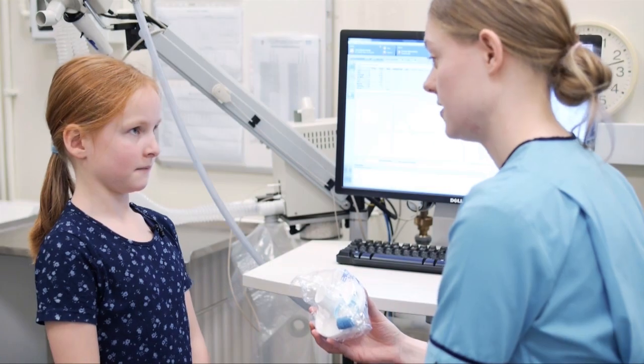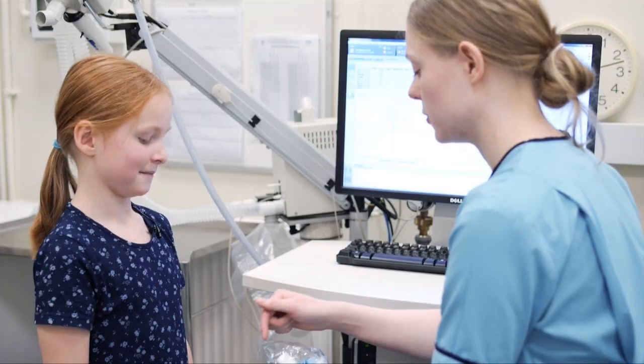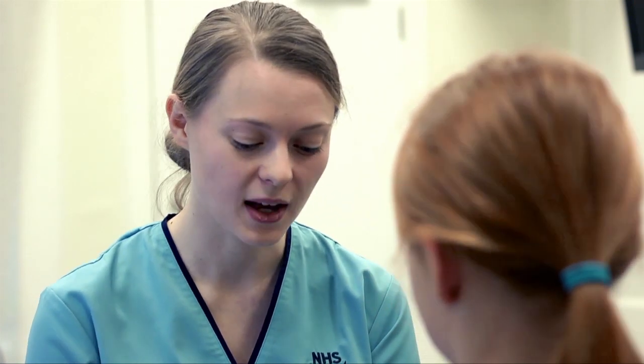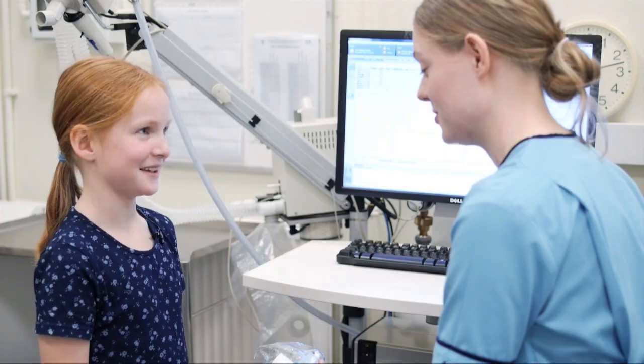Right Susan, we're ready to start now. Do you want to come across to my computer and we can have a wee look at the mouthpiece that we use for the tests? What we do is get people to put their lips and teeth around it nice and tight, but we don't want them to put their tongue too close to the opening just in case the air comes out funny.